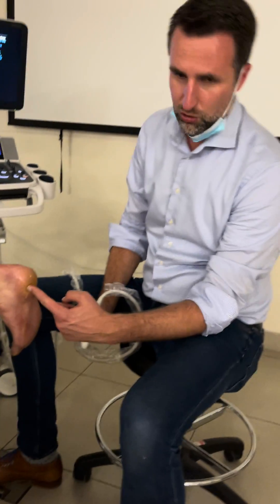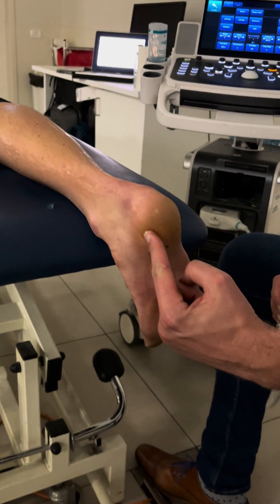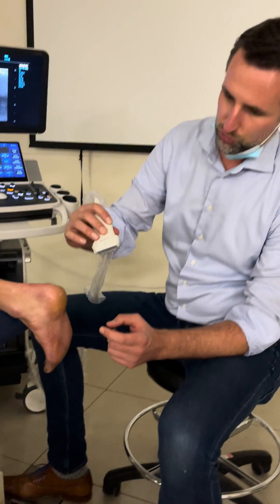If you see here, it's a little bit medial. This is the calcaneus and it's a little bit medial to the calcaneus. So this is the place where you're going to look — this is where you're going to put your probe.